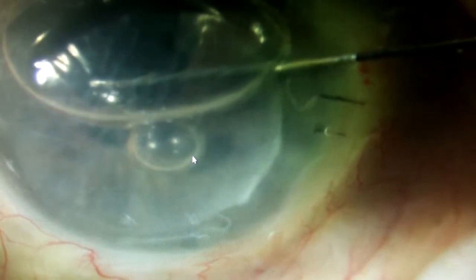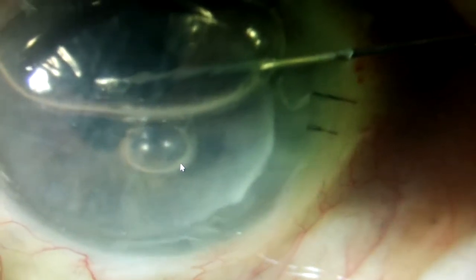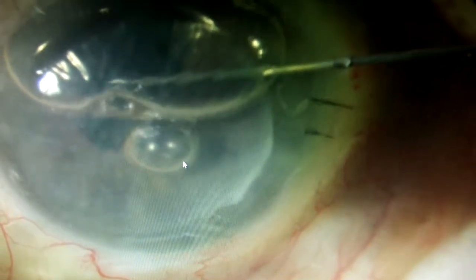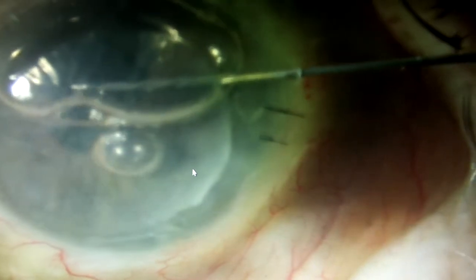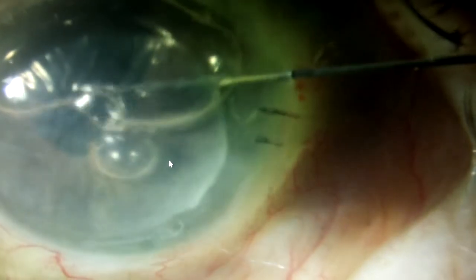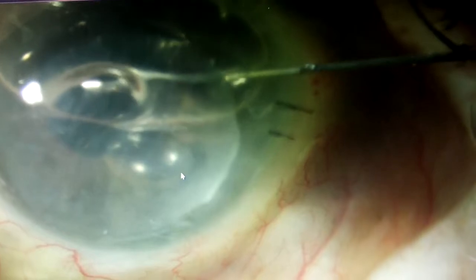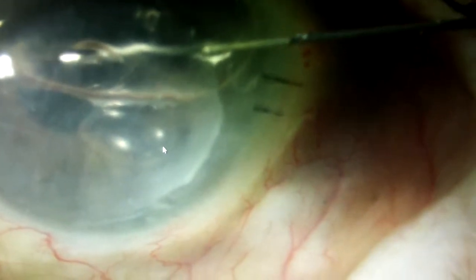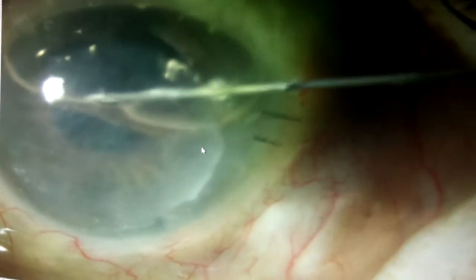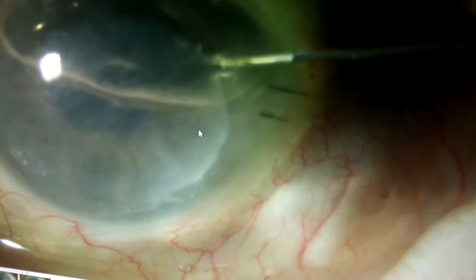As soon as I enter, a little bit of viscoelastic is initially injected, followed by the air bubble — which you can see right now occupying the superior half of the anterior chamber, locking the graft in position — followed by injection of the rest of the viscoelastic. The initial viscoelastic will hopefully prime the tubes so the air does not escape too fast, and the subsequent viscoelastic locks the air bubble in position.